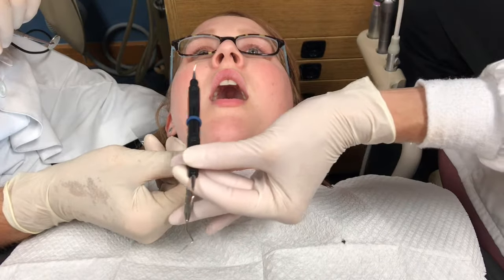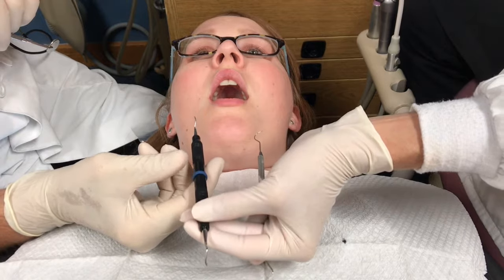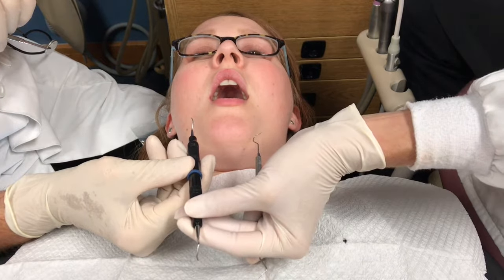Using the last two fingers of your left hand, retrieve the used instrument from the dentist, tucking the instrument in toward the palm.